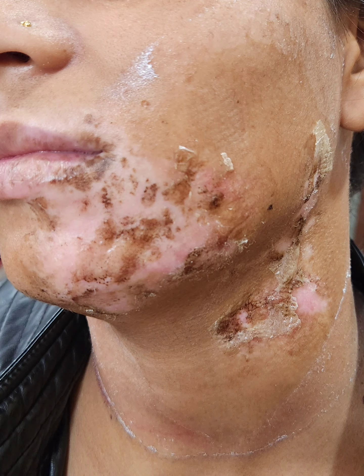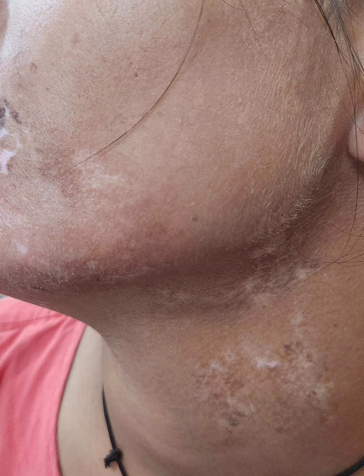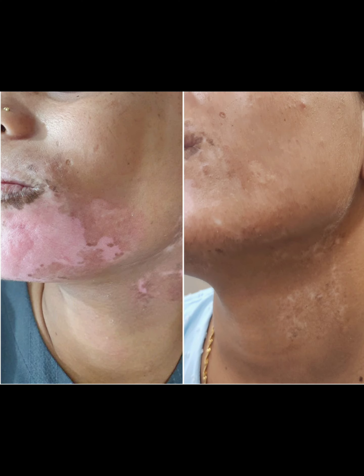The final dressing is done. After the dressing is removed at one week, the cells have taken up. This is after about three weeks of the procedure — the color has started to come. This is after about one and a half months, six weeks — a large amount of color has spread. This is the final result after about three months of surgery: near complete repigmentation has been seen, and the color is almost completely normal.